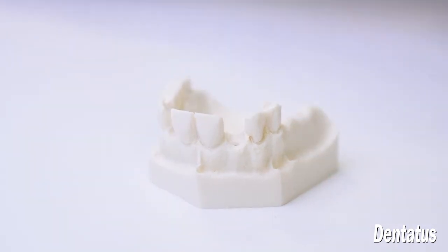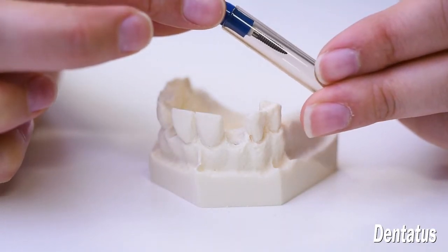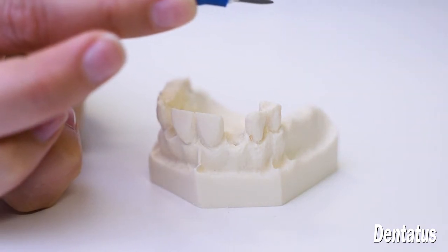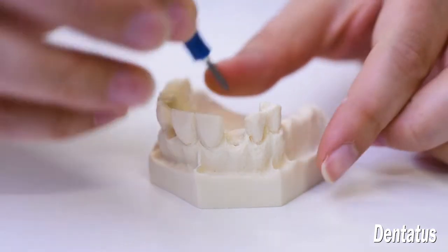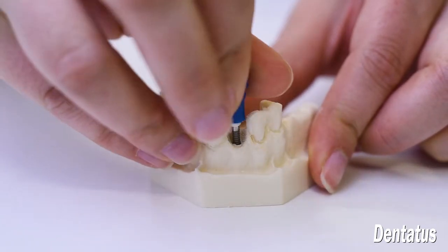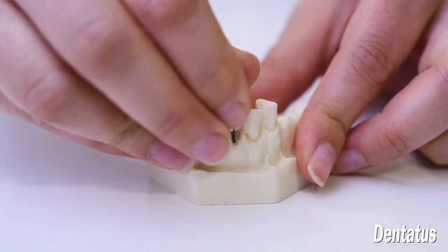New implants are pre-sterilized and have the gingival spacer and carrier driver pre-attached. The carrier driver is used to transfer the implant to the site. It will automatically disengage once the resistance of the bone is met. For initial stability, an installation torque of 40 Ncm is recommended.